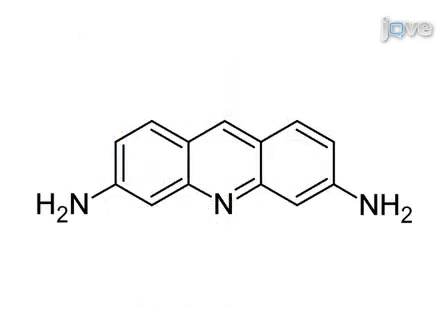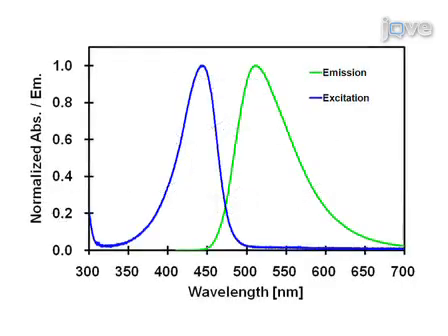This platform is designed to be used with proflavin as a fluorescent contrast agent, but can be configured to work with other fluorescent dyes. Proflavin is a bright nuclear stain with peak absorption and emission wavelengths of 445 nanometers and 515 nanometers respectively. The use of other contrast agents will require the user to select excitation, emission, and dichroic filters appropriately.